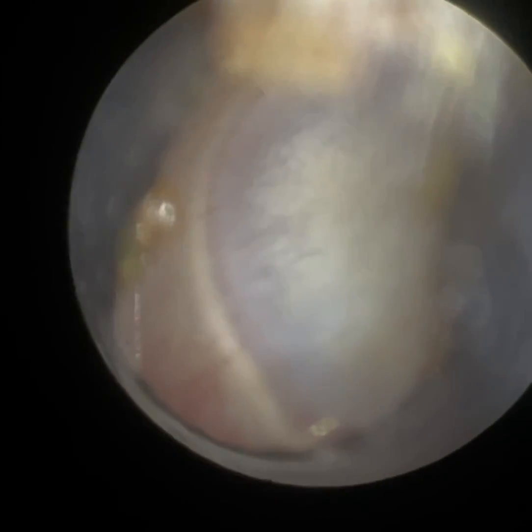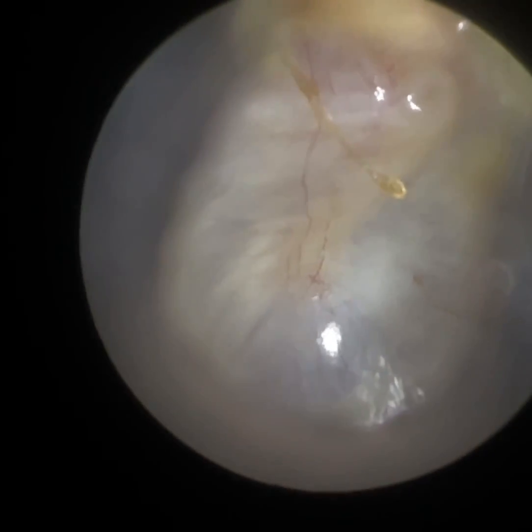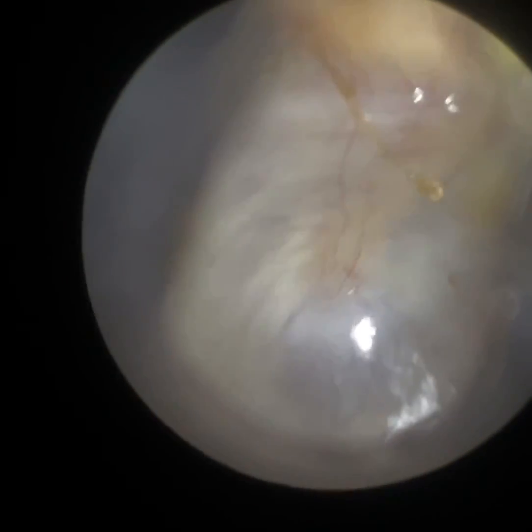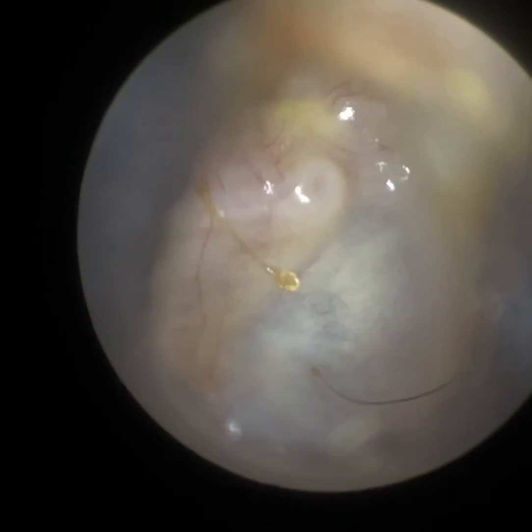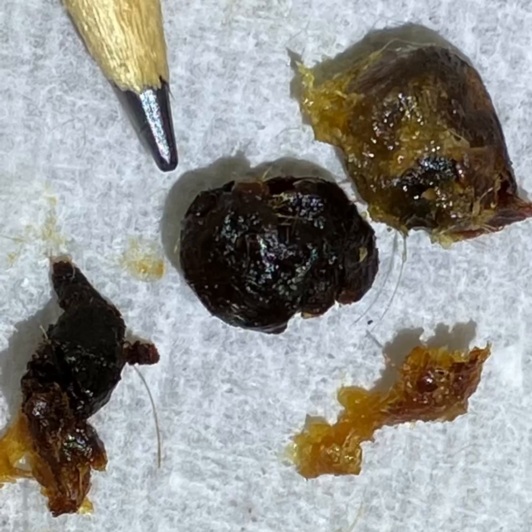I've managed to remove that. Going back into the ear — going right, then left, then back straight, stretching the ear open. Now getting the focus on the eardrum — you can see that amazing view. There's an attic retraction, the eardrum's quite opaque in appearance, some tympanosclerosis. You can see all the blood vessels supplying the eardrum and also the hammer bone. They have got a retraction pocket there, but it's not embedded with dead skin, so no cholesteatoma formation.